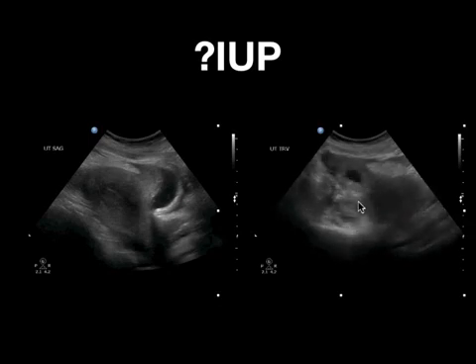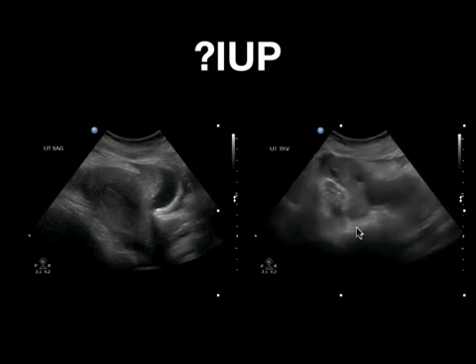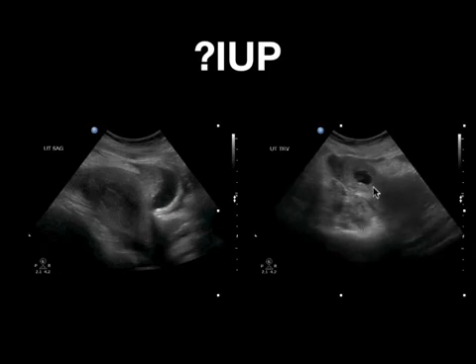As I go transverse, here you've got a sac with a yolk sac in it, but again, this is very eccentrically located to the right side of the uterus. This is a transabdominal transverse image, and I don't see a myometrial mantle surrounding this. Again, there's no myometrial mantle surrounding this area here. So this is a patient who had a ruptured right interstitial ectopic pregnancy.